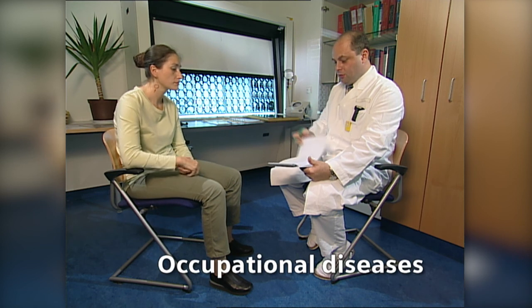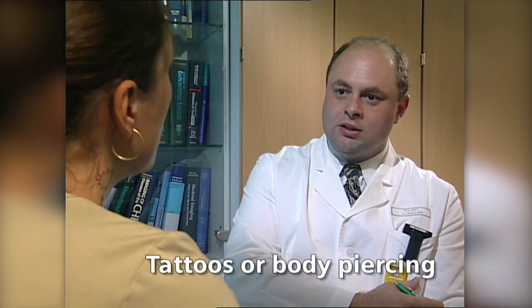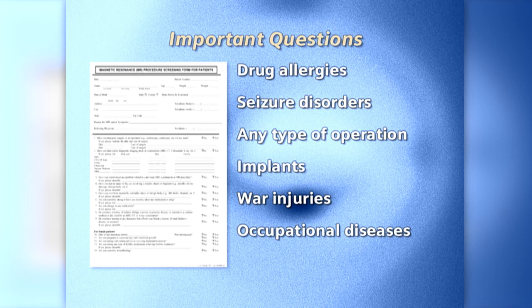Does the patient have any occupational diseases or injuries caused by welding or contact with iron? Does the patient have any tattoos or body piercing? Important questions: drug allergies, seizure disorders, any type of operation, implants, war injuries, occupational diseases, tattoos, body piercing.